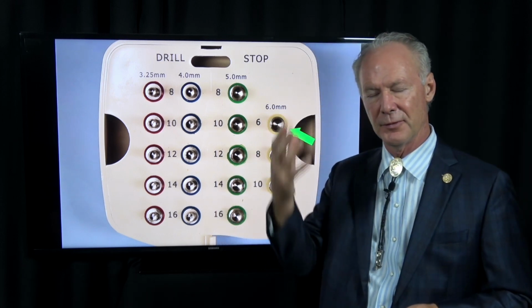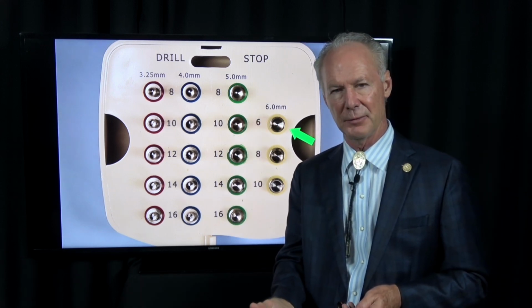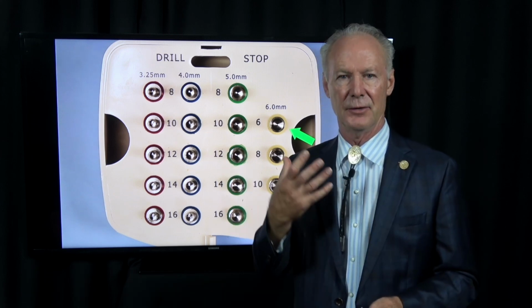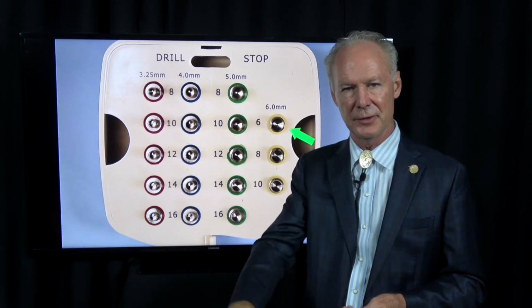If you reflect a flap and just drill straight into the bone, into the alveolar process, and put a flat healing abutment over the implant, then the tissue grows over it. When the patient comes back for the impression after 3 months, you have to re-anesthetize and punch a hole in the tissue. The emergence profile has not developed, so you don't know exactly where the tissue is going to be. So if it's an edentulous area, I like to drill straight through the tissue.